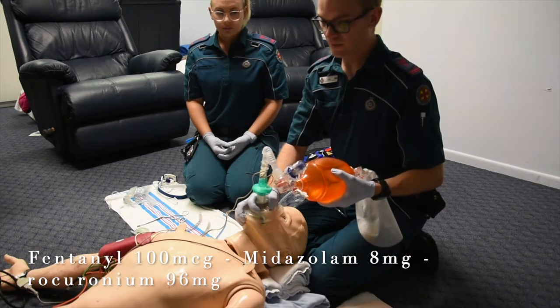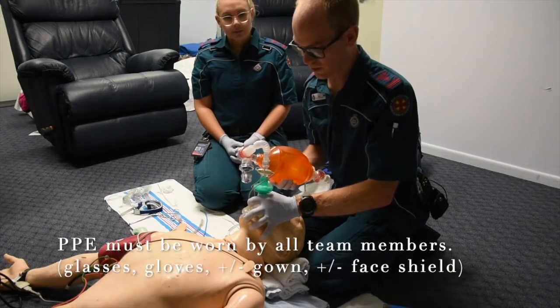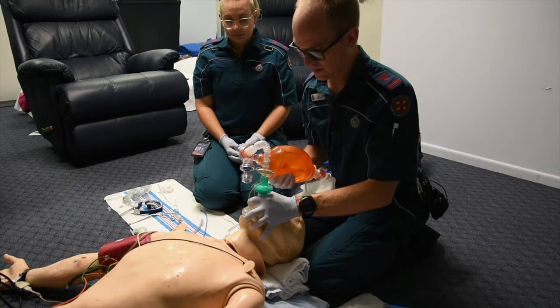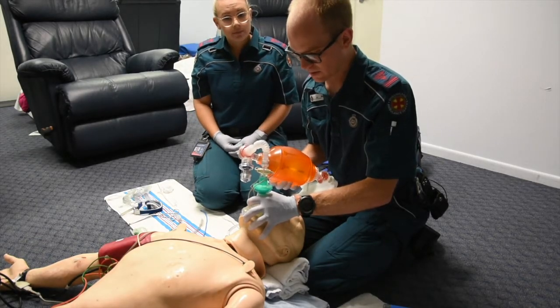And so once that happens, we'll wait for our patient to respond. Okay, so it's been 60 to 90 seconds since we pushed our rocuronium, so we're happy that that's taken effect. I can feel that it's taken effect. So are you happy to proceed with the intubation, Chrissy?